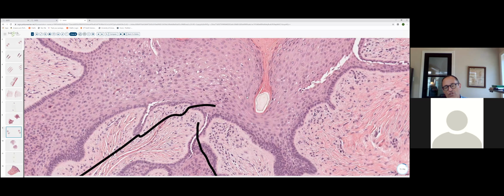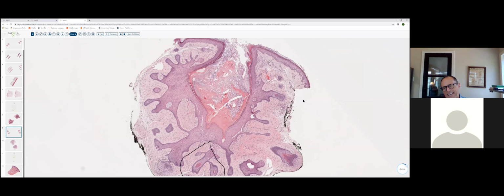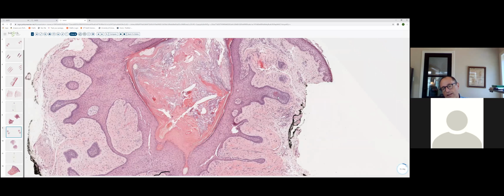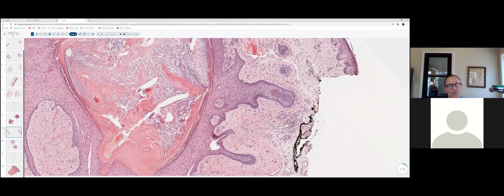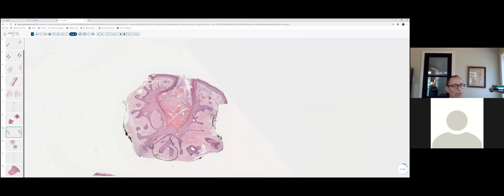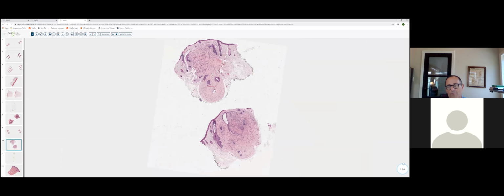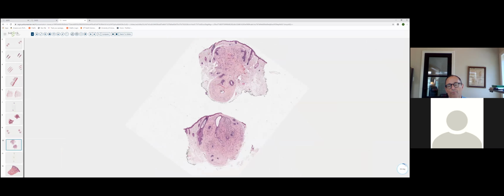So what distinguishes trichofolliculoma from dilated pore of Winer and from pilar sheath acanthoma is clearly well-developed secondary follicles. And again, look for inner root sheath, outer root sheath, inferior portion. So this is a trichofolliculoma. Most people have no problem with this particular tumor. It's so distinct. And I threw in slide 10. It's a little different looking histologically, but the nomenclature causes some confusion.